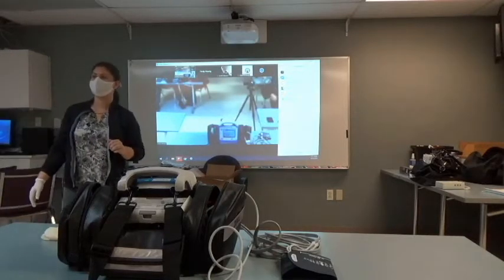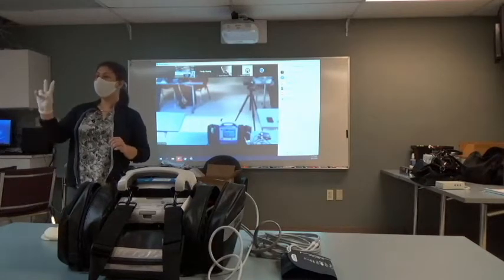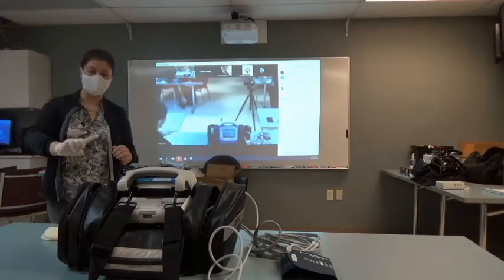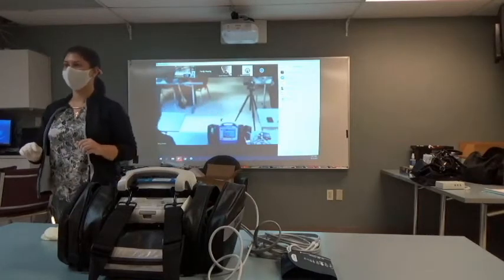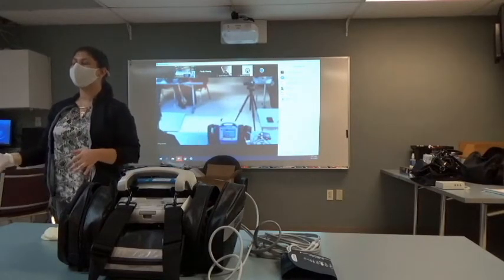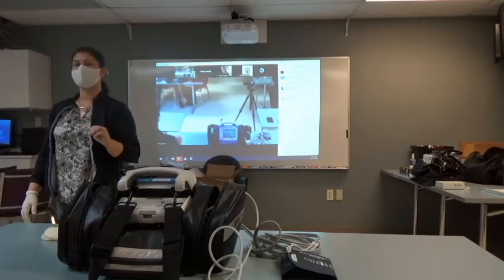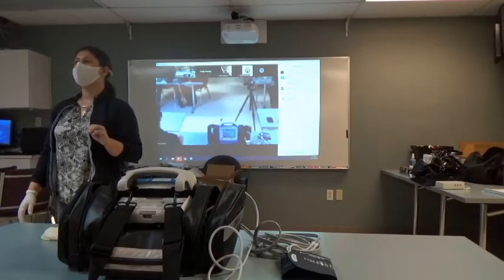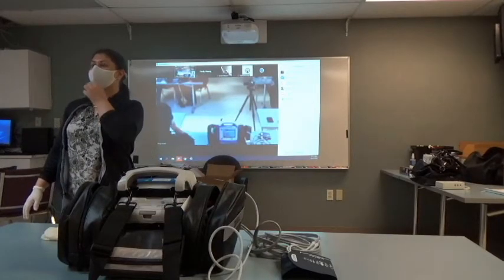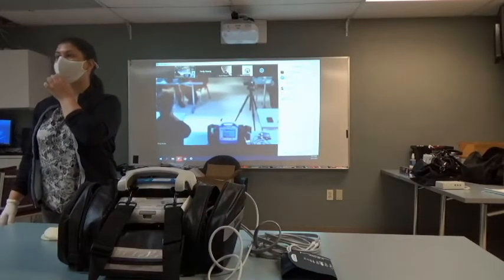It'll only take a blood pressure if you don't set the time when you push the button, okay? It has 2 options to take a blood pressure. Either I press the blood pressure button and I take one manually with a manual button push, or I set it to do auto blood pressures and I create an interval. But you have to set it. It's not automatic like every 3 and every 5. It can be programmed that way. Currently, it is not programmed that way.